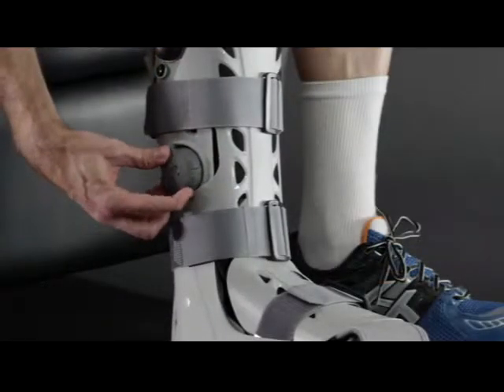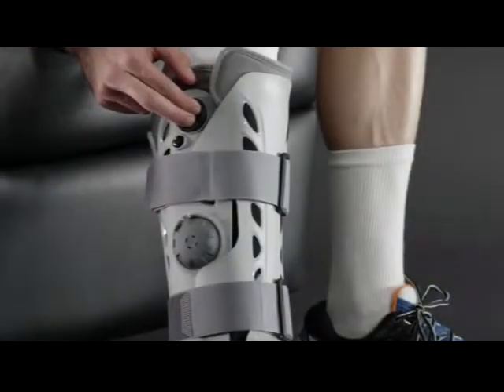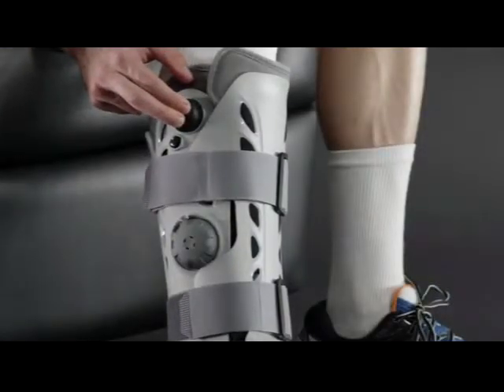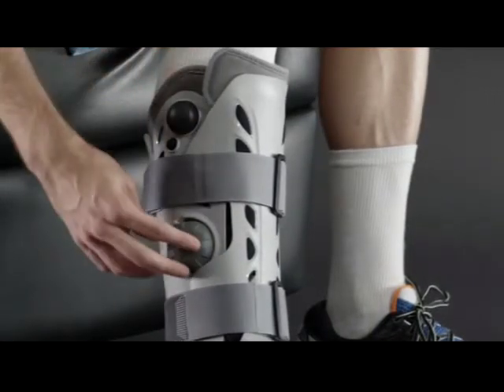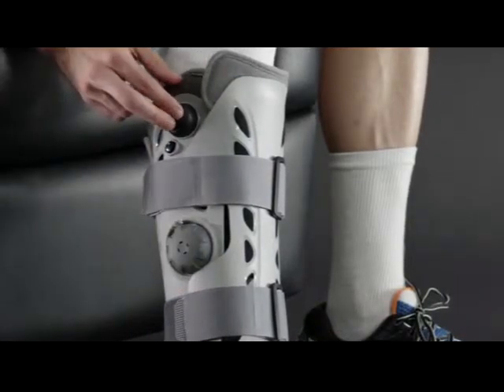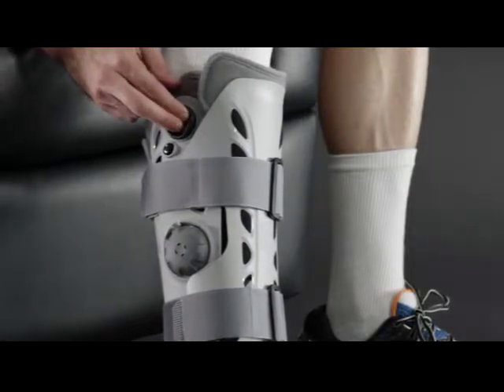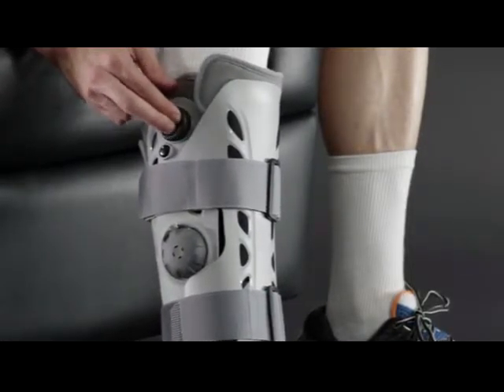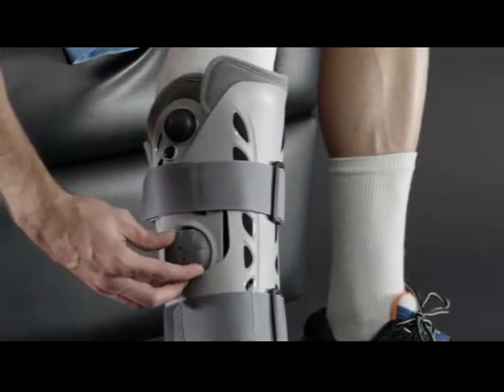Once you've turned the selector to the appropriate AirCell number, press and release the large inflation pump on the top right of the boot. Pump until the AirCell feels snug but not excessively tight.